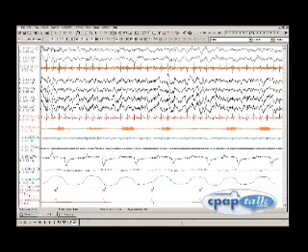Sleep studies involve a recording of sleep called a polysomnogram. To the untrained eye, they look like lots of squiggly lines, but to sleep disorder professionals they are a moment-by-moment detailed view of your sleep and the basis of an accurate diagnosis.